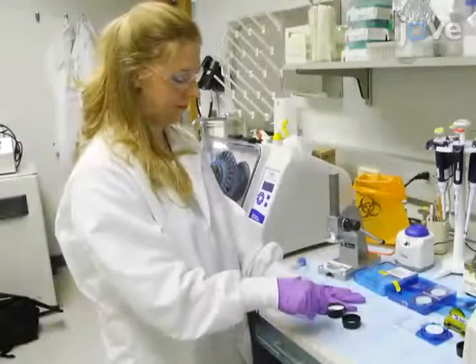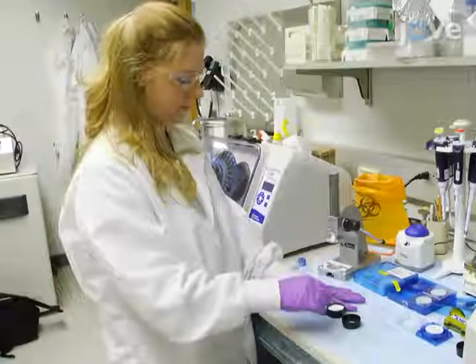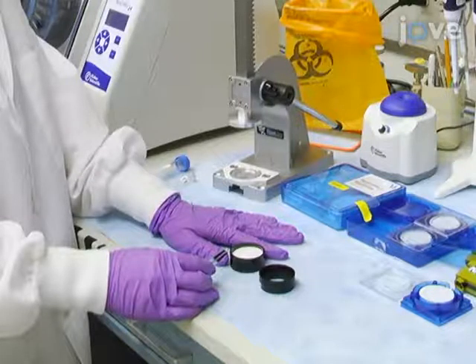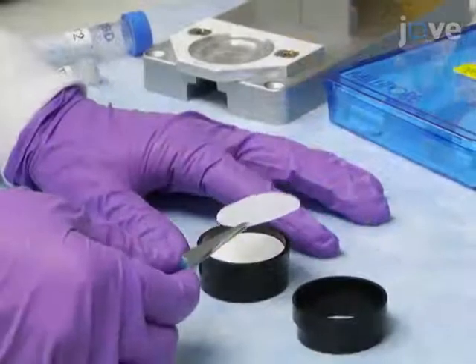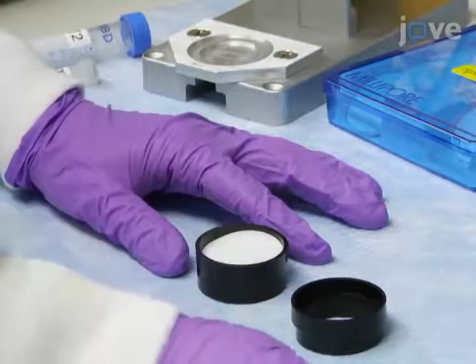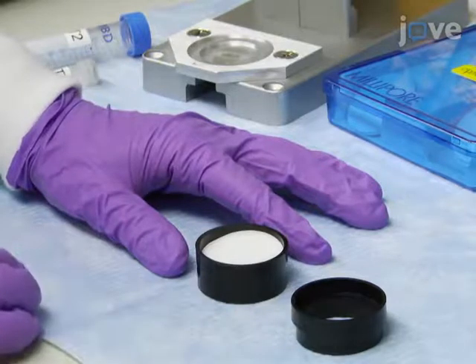To assemble the air sampling filter cassette, place a cellulose filter support pad on the gridded surface of the base piece. Then, with the help of filter forceps, place a filter on top of the filter support pad with the collection side facing upwards.